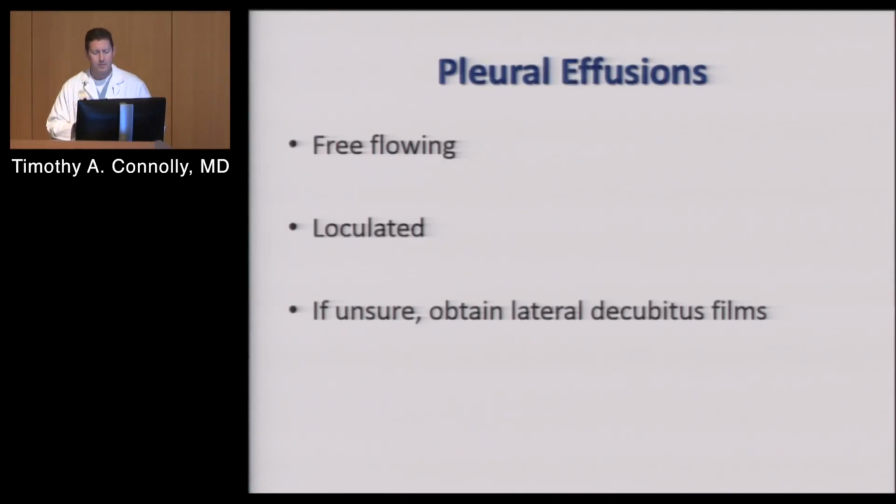Pleural effusions. I didn't appreciate this as much when I was in training as I do in practice, because pleural effusions really do come in 2 basic flavors. There's free-flowing, which means it's easy to deal with. You just drain it, get a thoracentesis, I'll do it, you guys do it, whoever, it's not hard.